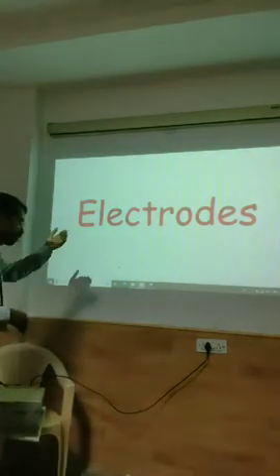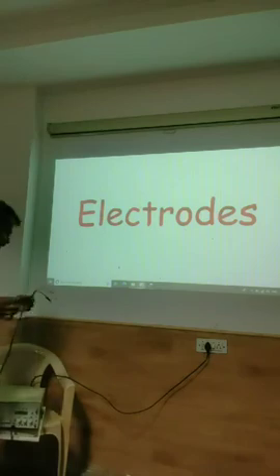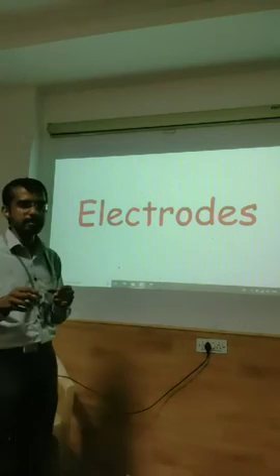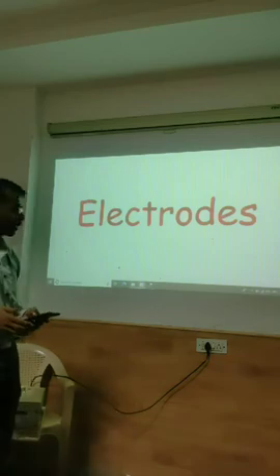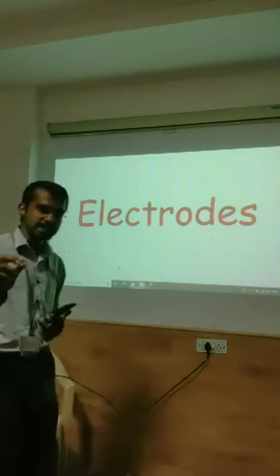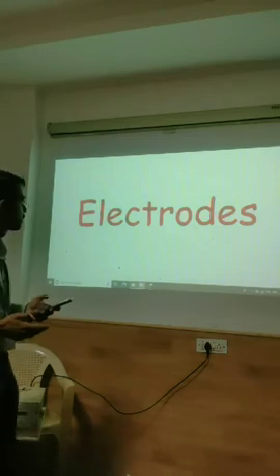Electrodes are also metal, like this cable wire, but they are designed precisely for picking up signals. So that's what we are going to deal with. Let's go again: the need for an electrode is to pick up the correct signal from the correct part of the body. Else we will get a signal, but we cannot identify what kind of signal it is or where it originates from.